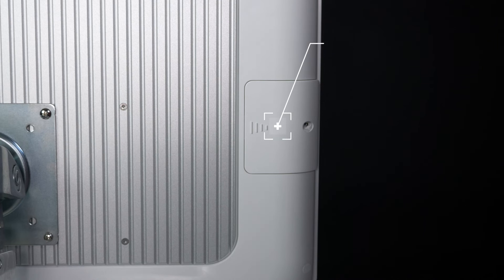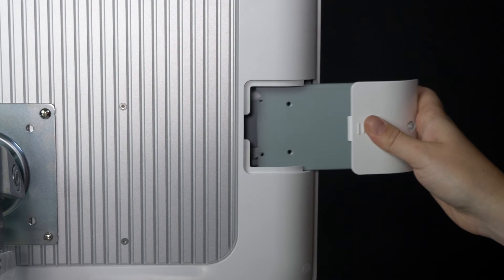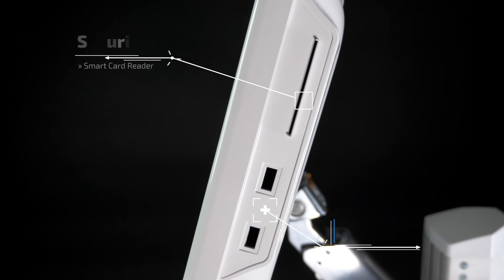This computer also has a 2.5-inch SATA HDD drive bay with an accessible door, VESA mount, and side USB ports for easy access.